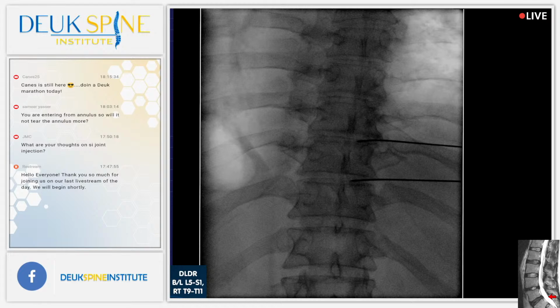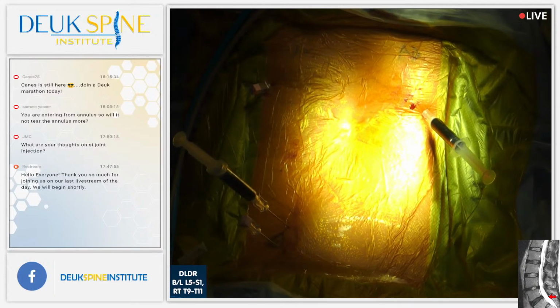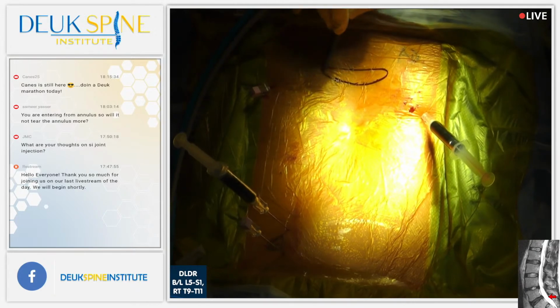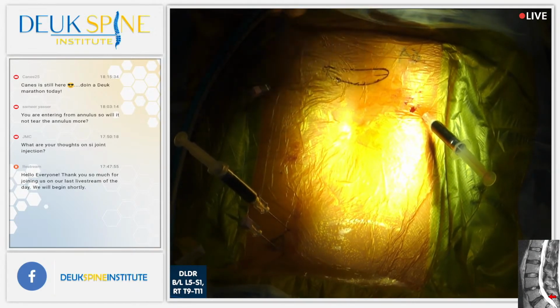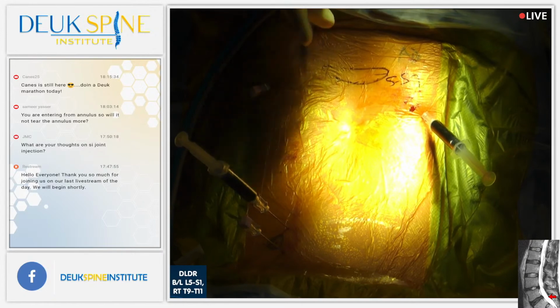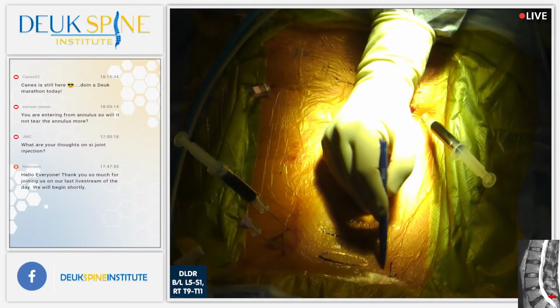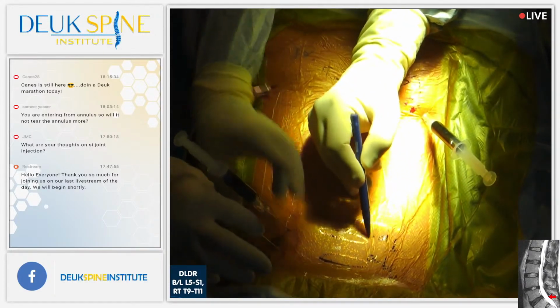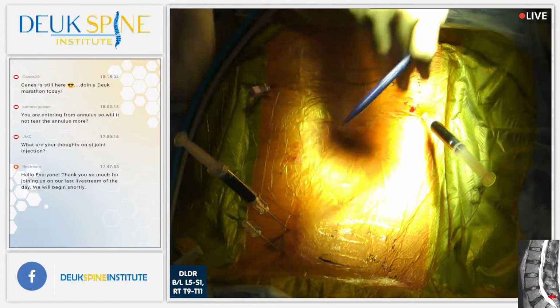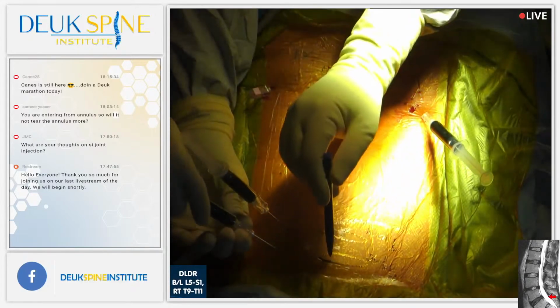All right, so we're going to let our patient wake up, and then we're going to test his discs. So he's come from far away, and we know L5-S1 is a likely source of his pain because he has a double herniation, one on the left, one on the right with annular tears. L5-S1. And his pain was localized right there. Then he also has pain up here in the thoracic spine at T9-10 and T10-11. How do we know that? Well, we actually had him localize where his pain is. We put paper clips there and we did an x-ray, AP thoracic, and it showed the paper clips exactly at 9-10 and 10-11.